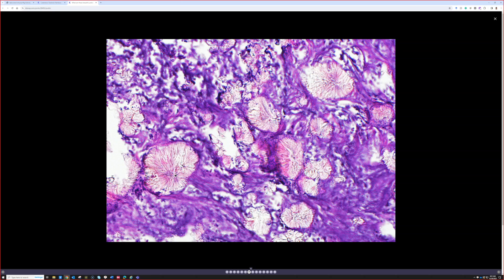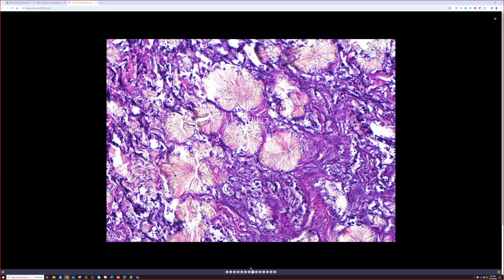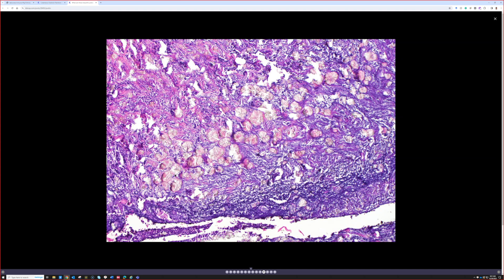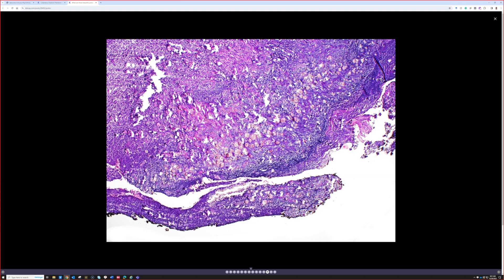Even though we say needle-shaped, they don't look really like gout to me at all — the way they're arranged together doesn't look like gout. Also, as far as I know, they survive the normal H&E staining process, whereas gout crystals are usually mostly dissolved during that process. This case had just tons and tons of oxalate with extensive inflammation in the background skin, but it was through a teaching slide exchange, so I don't remember what the clinical scenario was.